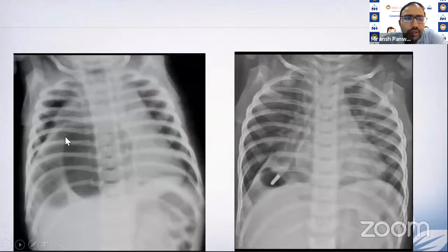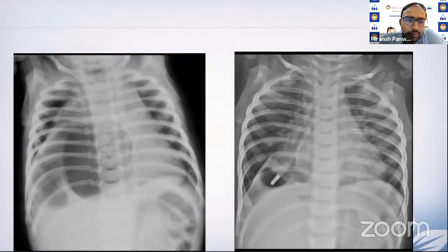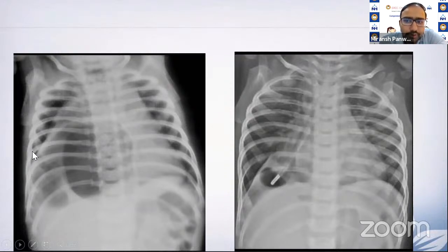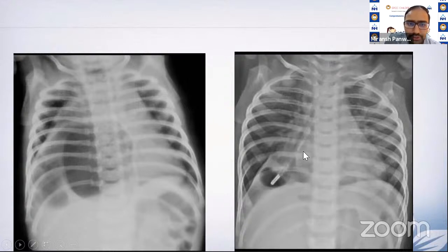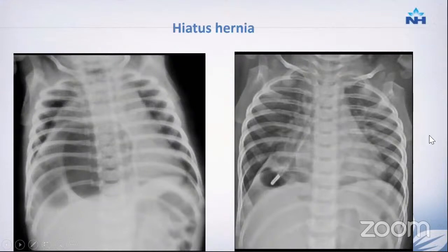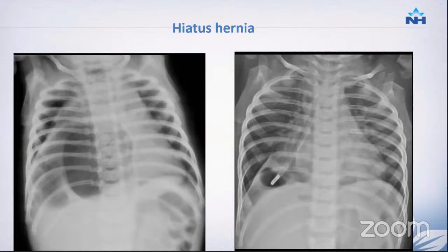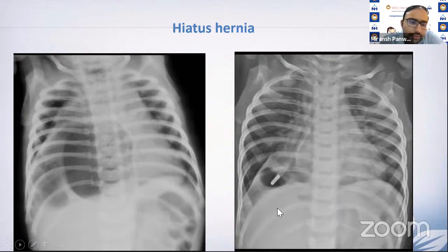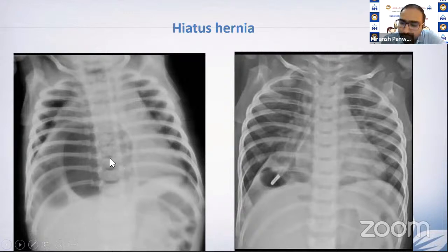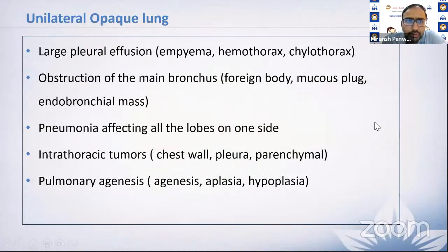Sometimes a large gas shadow in the mediastinal area causes whitening and you wonder whether the stomach has herniated upward. A simple step: insert an NG tube and take an X-ray — if the NG tube tip confirms the stomach's location, you can identify it as a stomach gas shadow, diagnosing hiatus hernia or other types of herniation. This reinforces that you must look not just at the lungs and mediastinum but also below the diaphragm — if the stomach shadow is absent from its usual location, you should be concerned.